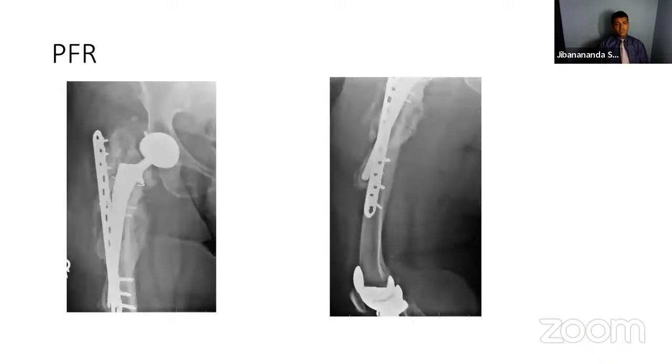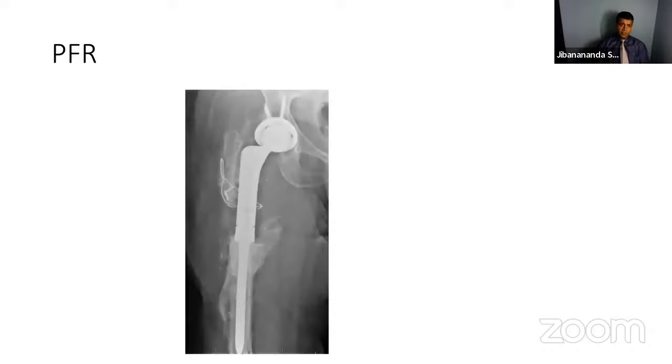This is a patient that was referred to me for revision, again a complicated situation. The patient had a broken implant, and the outside surgeon didn't recognize it intraoperatively and had a difficult time. Then the femur broke, and the stem also perforated. They tried to salvage it with a plate, and unfortunately the intraoperative perforation of the stem was not recognized. But this patient walked on this for 2 years until she was seen by me.